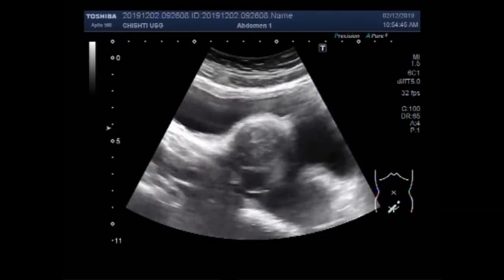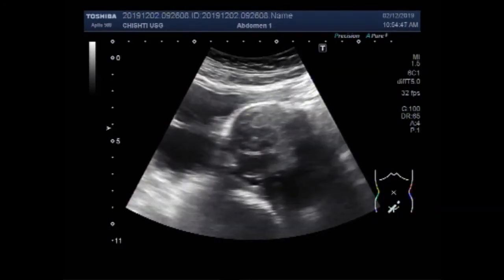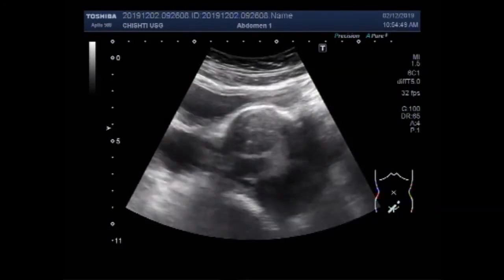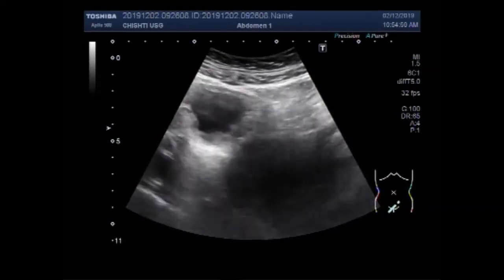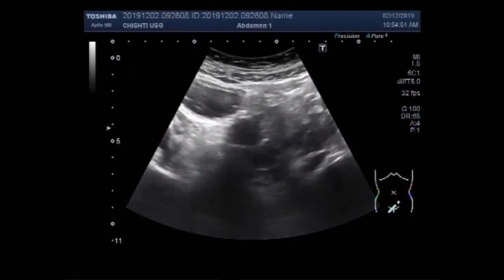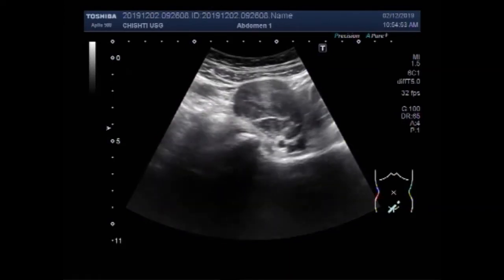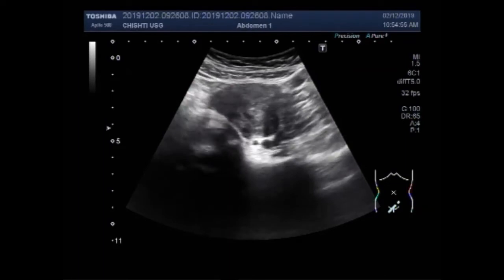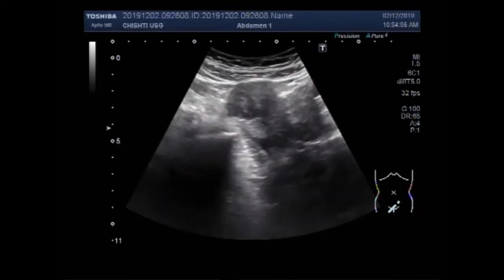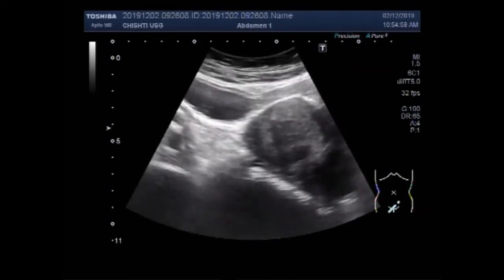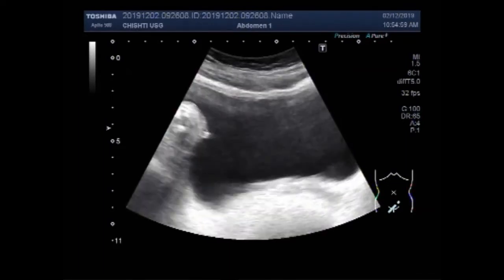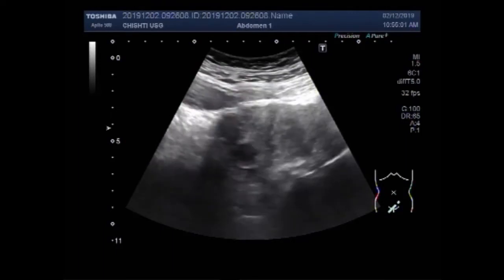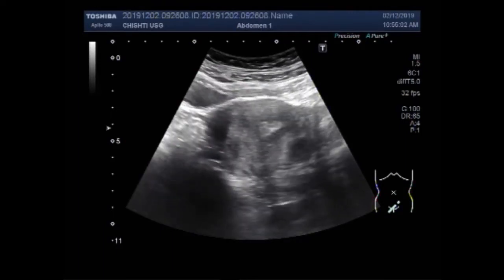Now you are going to see the ovaries along with the uterus.